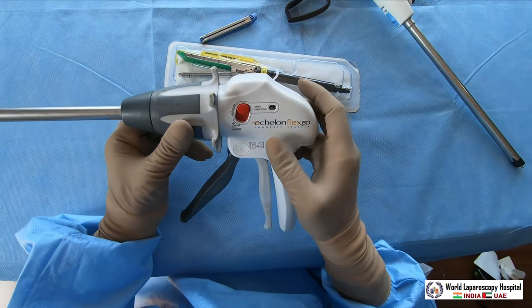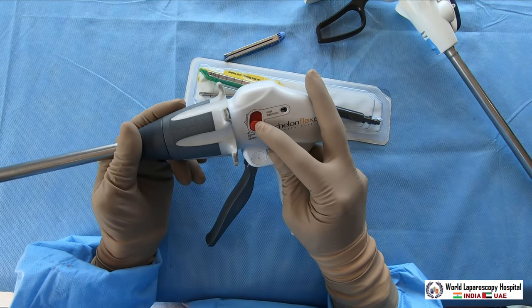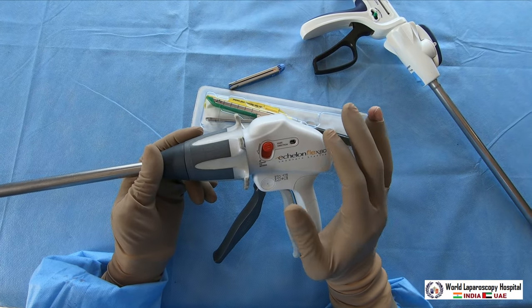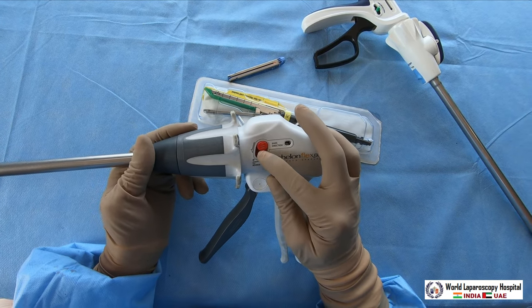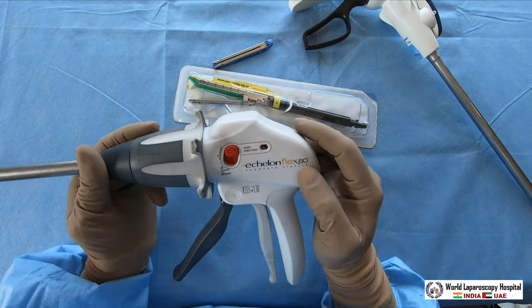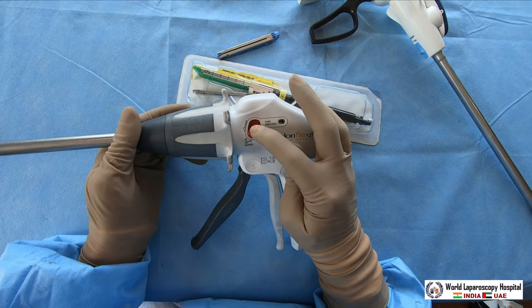Sometimes when you are firing and you do not want to proceed further, you can press the reverse button and the blade will return back. In any position you want the blade to return - even if the staple has been placed but you do not want to cut - just press it and it will return. There is a back arrow button which when pressed returns the blade to the starting position.